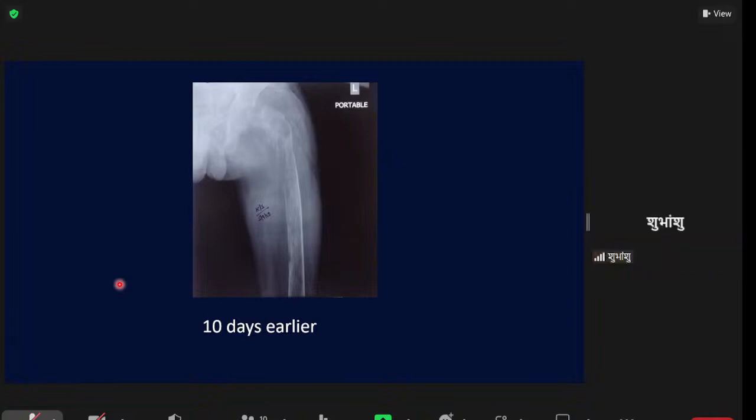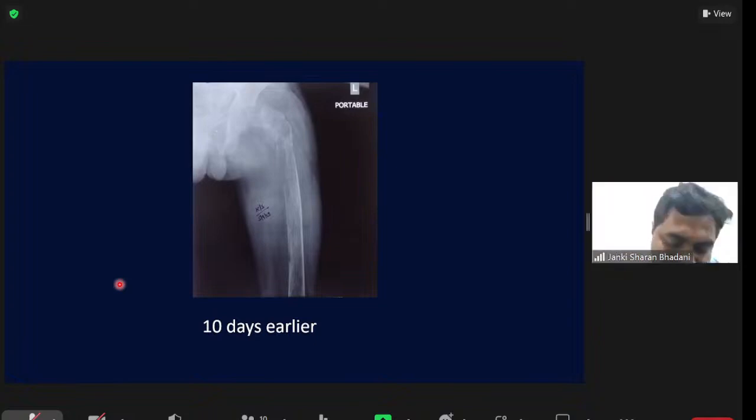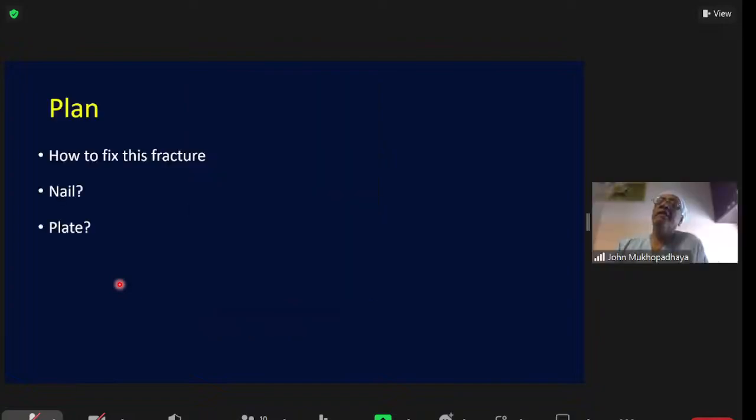More than 85, no? Length, sir, of the plate. How many holes? Side plates, sir, is asking. Yes, sir. Till what length do you want? We have to do a long PF nailing with anything which is long, because the bone quality is not good till the shaft or distal femur. Okay, so let's see.